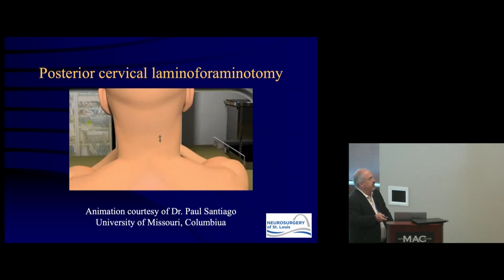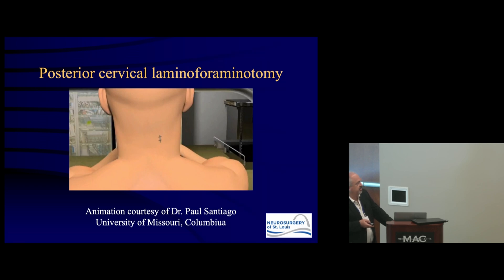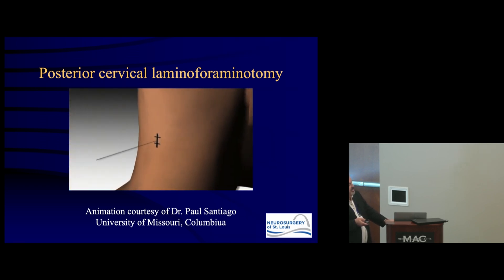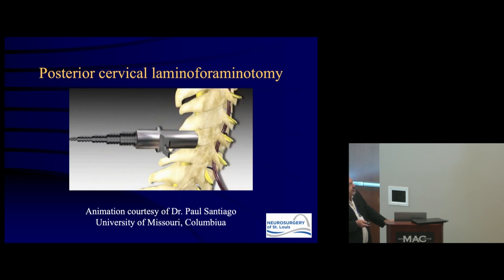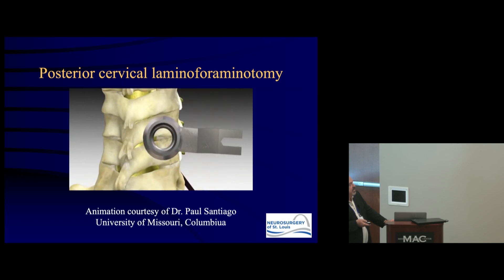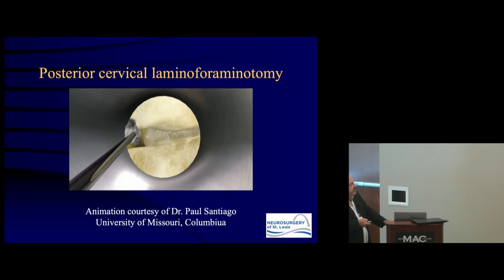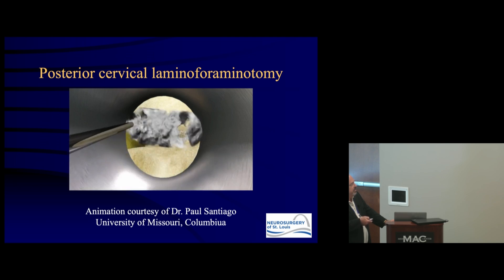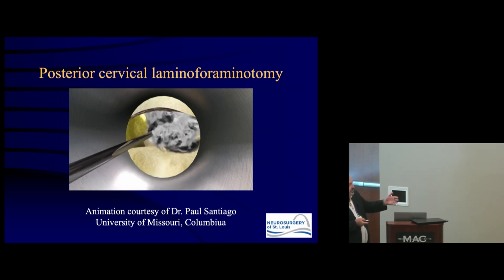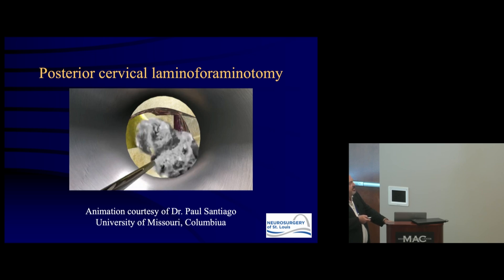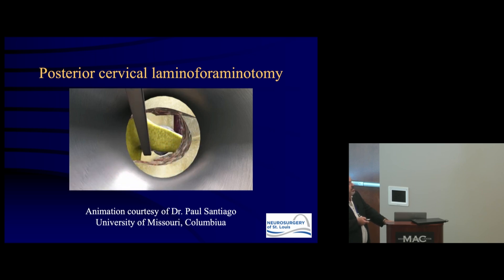For visualization, here is a 3D animation from my former partner Paul Santiago, now at University of Missouri-Columbia, showing a tubular approach for foraminotomy. The tube docks on the inferior facet. We're looking at the inferior facet, the superior facet, and the medial border at the edge of the spinal canal. The medial portion of the inferior facet is removed to visualize the superior facet, which is also partially removed along with some of the leading edge of the lamina to expose the exiting nerve root.